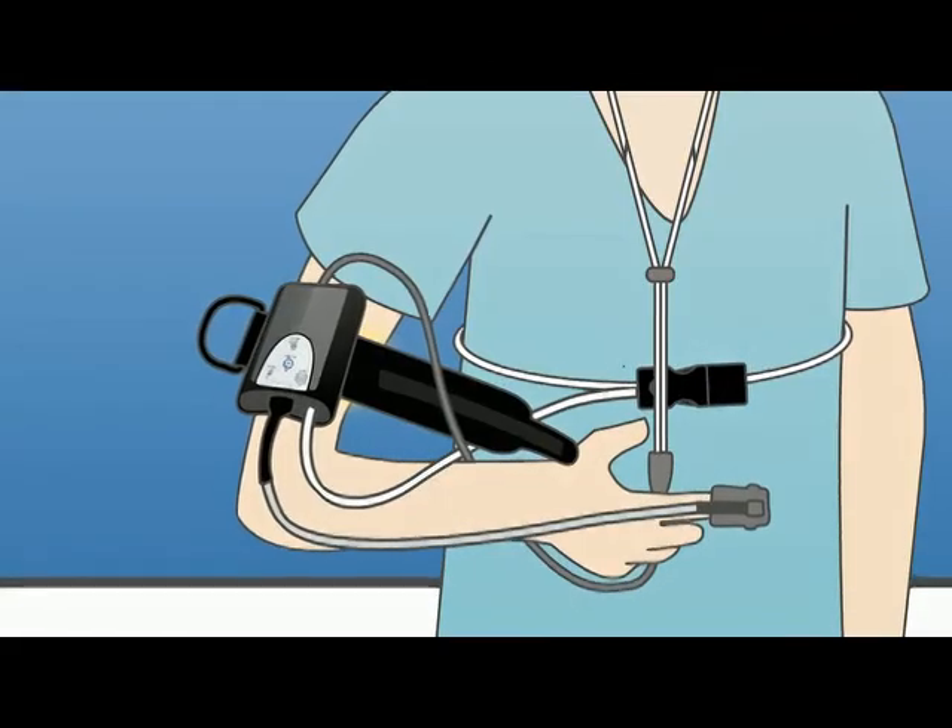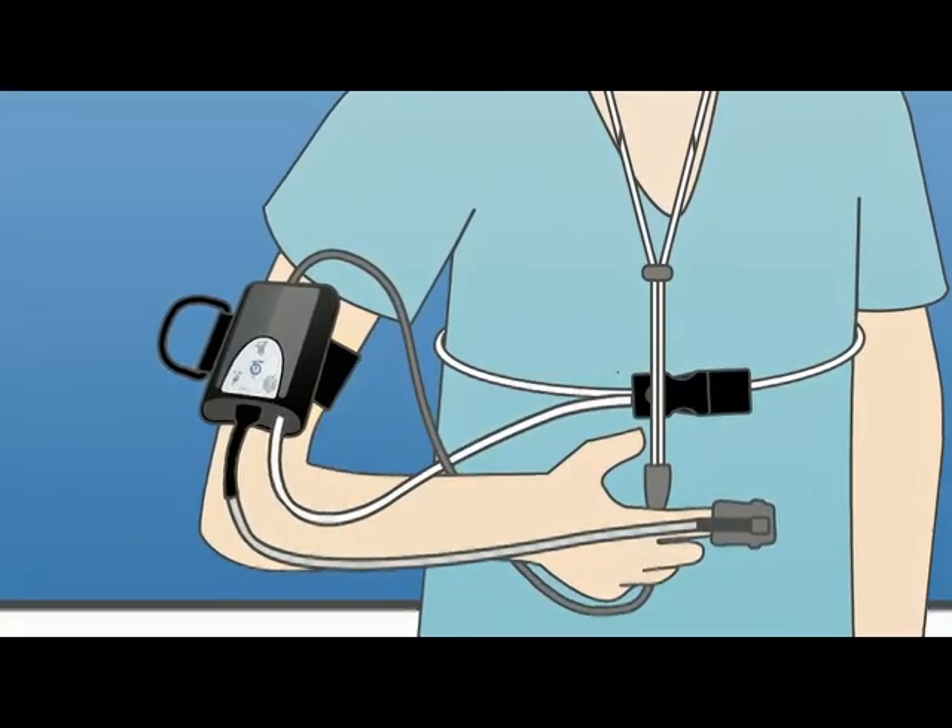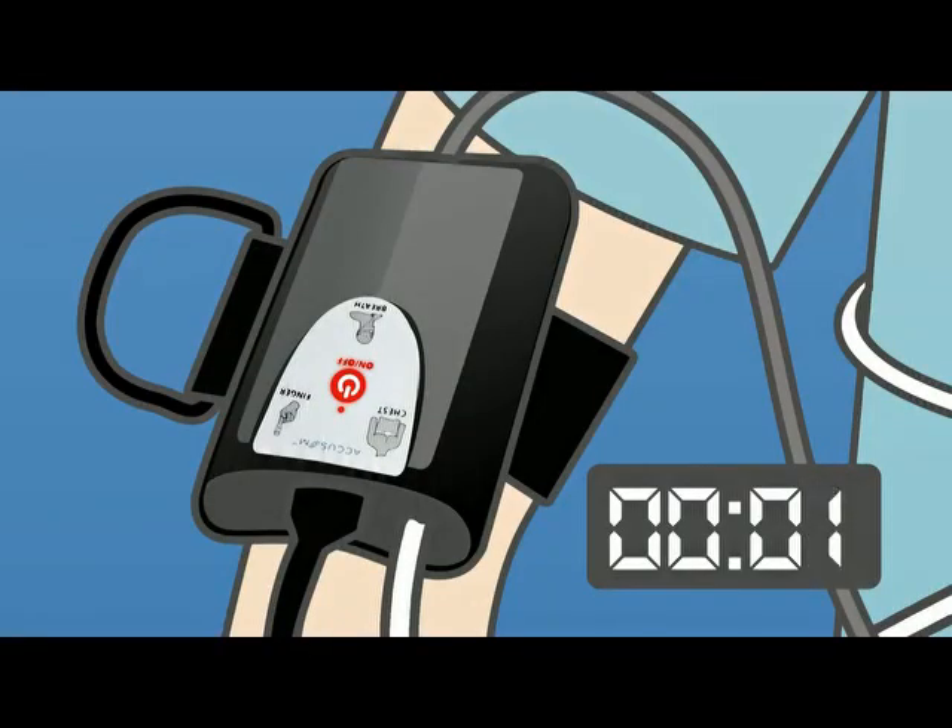The last step is to strap the device to your arm, then turn on the device by pressing and holding the on/off button for five seconds and letting go.